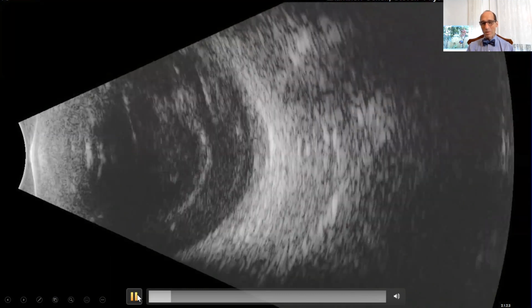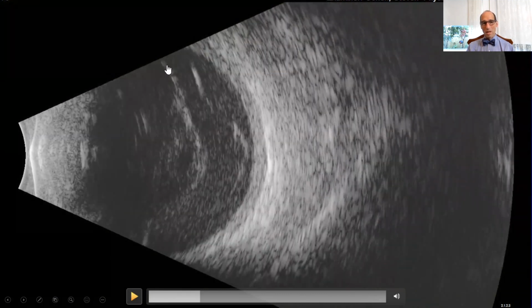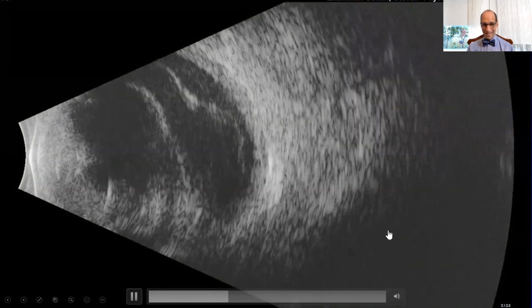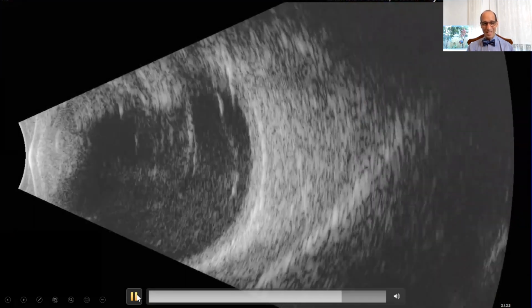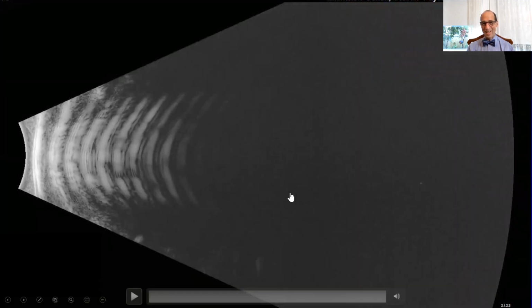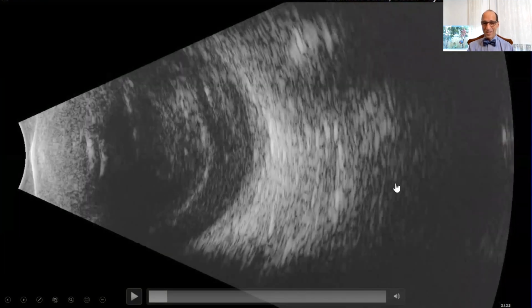This one I thought was one of the more tricky ones; I tricked other retina specialists with this one. Because you think, oh, there's a PVD, so that's a detachment. But this is actually just vitreoschisis. I did take this patient to surgery because this didn't clear for a while, and I can tell you there definitely was not a retinal detachment. The other thing is if you do go into retina, don't trust your B scans. Even though you do them yourself, and I can tell you for teaching purposes, 99.9% that's not a detachment, you still go slow because you can be wrong.